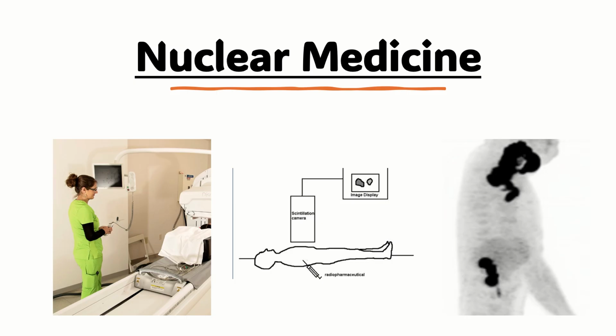The tracers are usually given by IV injection but can be inhaled, swallowed, or directly injected, depending on what needs to be examined. Regarding radiation dose, the level is similar to that of a chest X-ray or CT scan. Nuclear medicine is driven by constant discovery. Advances in molecular biology, radiopharmaceutical development, and imaging technology are transforming how we detect and treat disease.